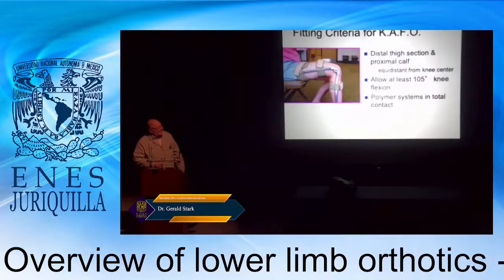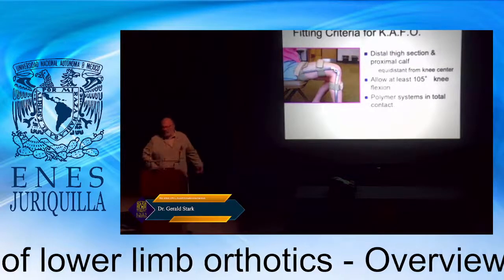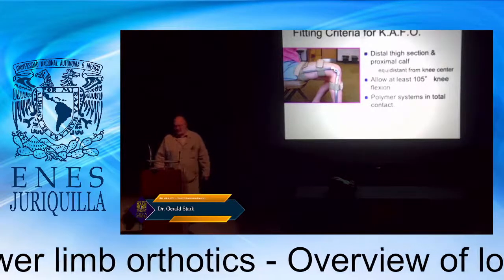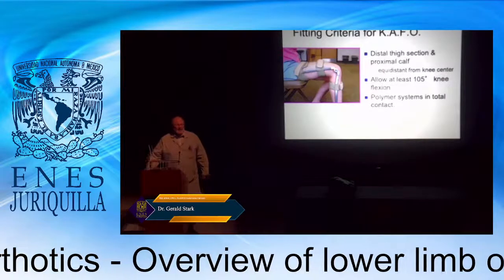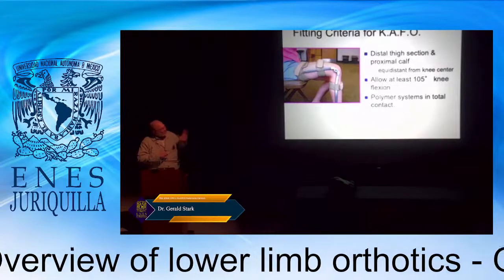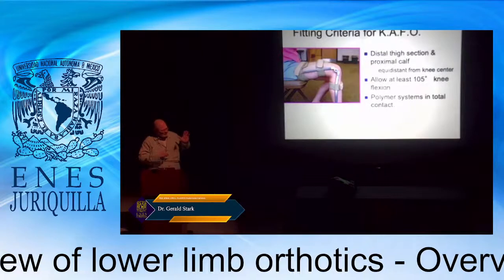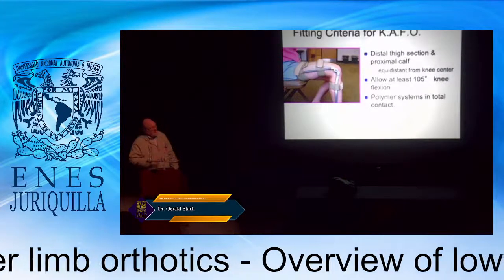So what we want to see is the patient be able to sit down and have the knee joints aligned. Remember that the knee joint is polycentric, so it's often difficult to achieve that. Most of the time, it's located about 40% from the posterior, 60% from the anterior of the knee. And so that's where we place it, near the medial condyle.